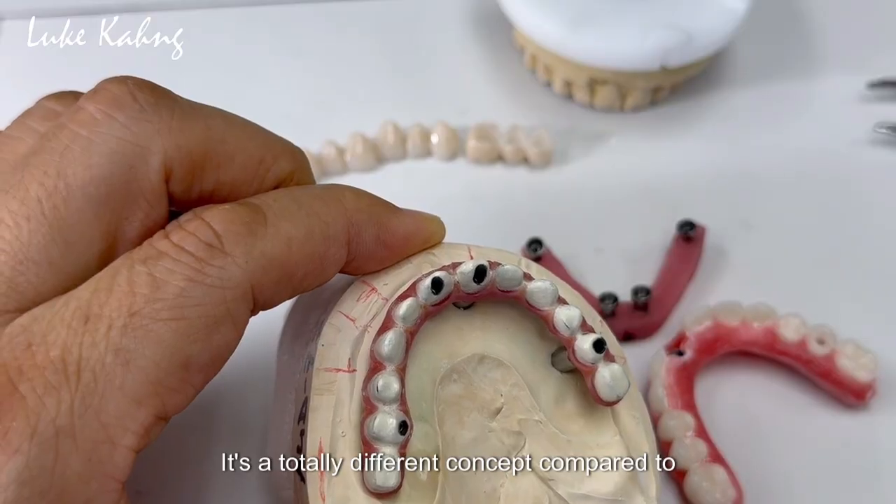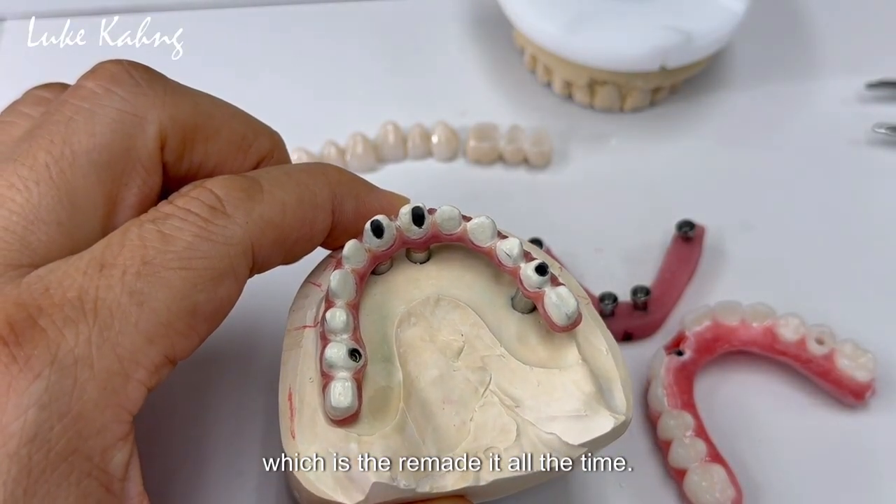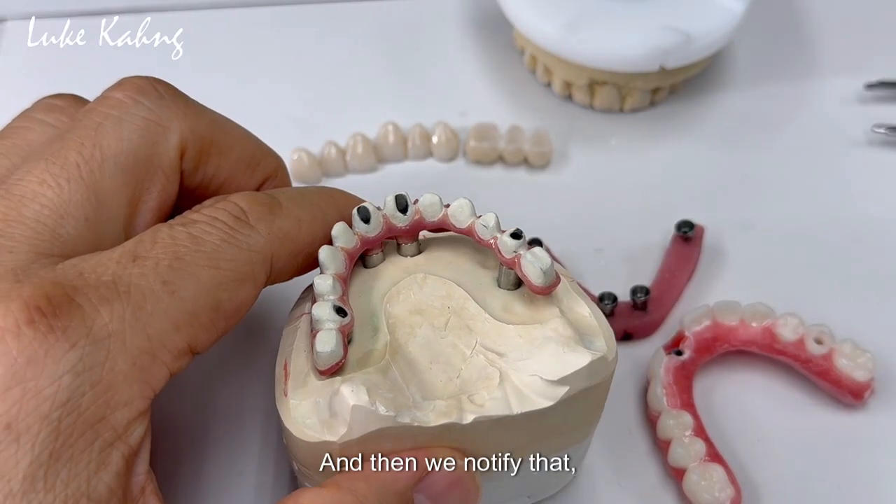It's a totally different concept compared to the zirconia which we made all the time, and we know it by that.